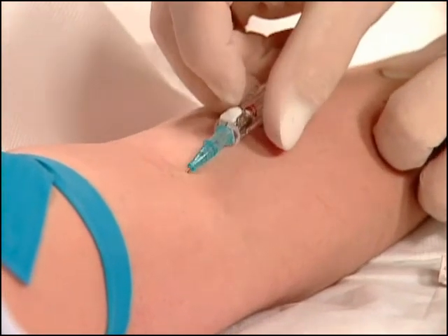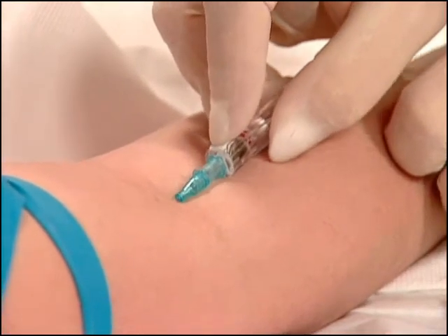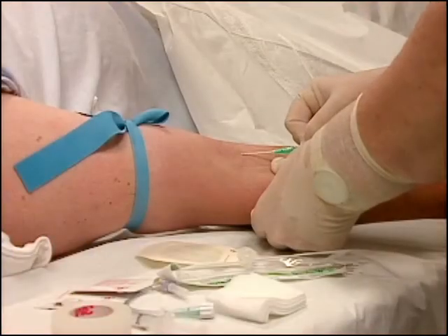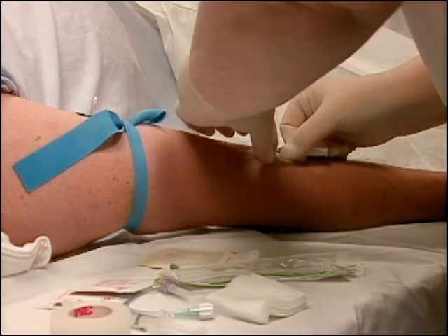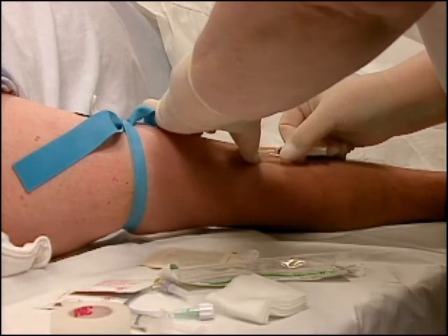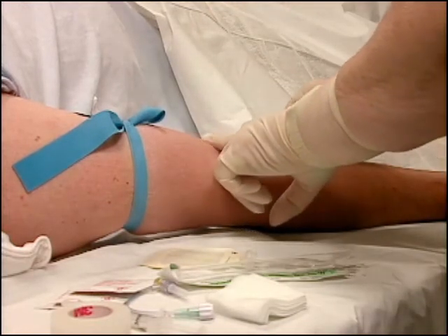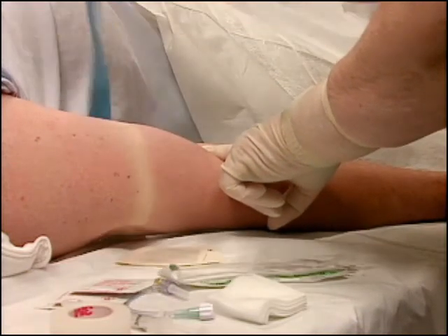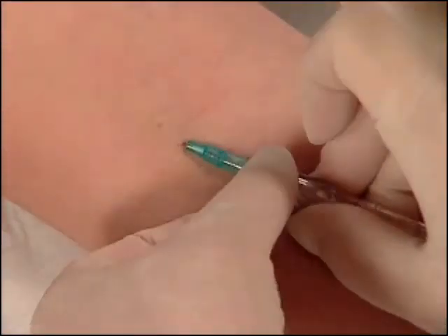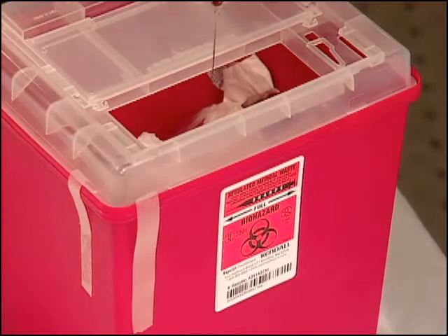Advance the catheter forward in the vessel over the stylet until the hub rests against the patient's skin, but the stylet is not fully removed from the catheter. With your non-dominant hand, occlude the vessel above the insertion site at the tip of the catheter. When the vessel is occluded, remove the constricting band by pulling on the loose end. While still occluding the vessel, remove the stylet and dispose of it in the sharps box.